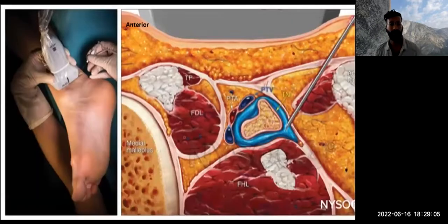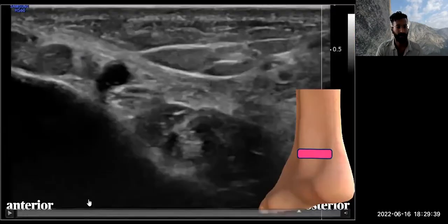Okay, tibial nerve. So the landmark for the tibial nerve is the posterior tibial artery. So we want to be scanning around the medial malleolus or proximal to the medial malleolus, looking for that posterior tibial artery. The other things around it, it usually sits in a kind of triangular fascial compartment, bounded by the flexor retinaculum and sitting on the belly of the flexor hallucis longus muscle. So getting the local anesthetic into this triangular compartment is the key to getting this block adequately covered.